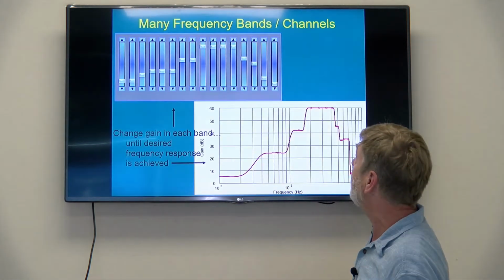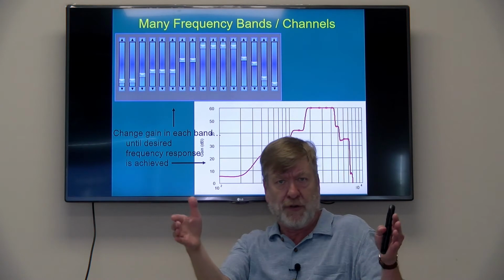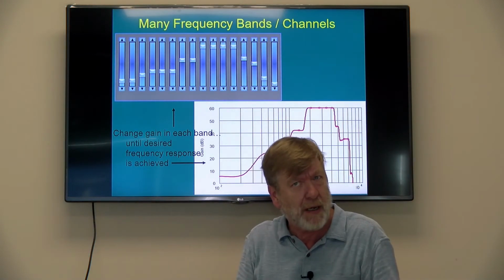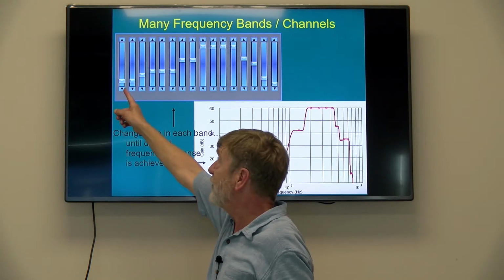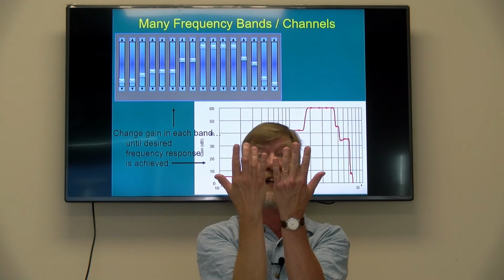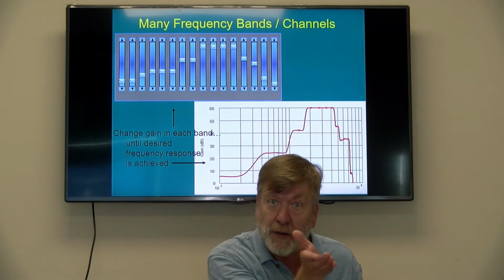That slide we've seen. Look at what's happening in digital hearing aids. They have lots of channels. It almost looks like an equalizer on some of these things that people play in their cars or at the back of a bar when music's playing, the music person is adjusting all these buttons. Hearing aids can control the amplification exquisitely at different frequencies. So you can think of it, instead of just amplifying sounds, you've got all my little fingers, and each finger is a particular little band. And I can raise or lower these, depending on the shape of the person's hearing loss.